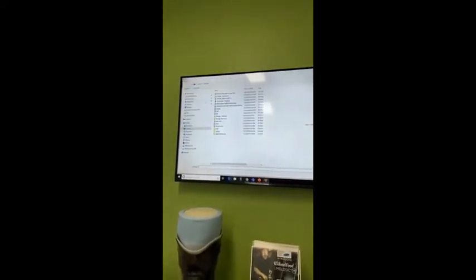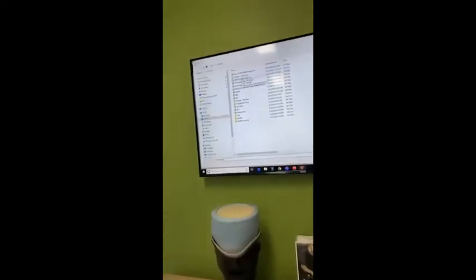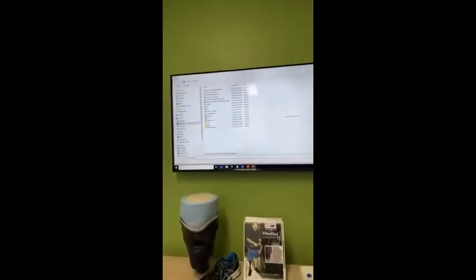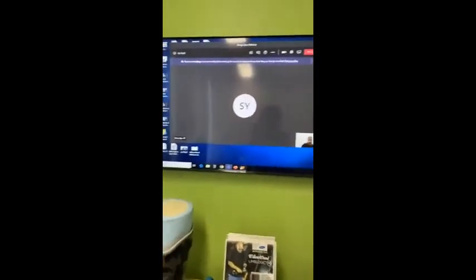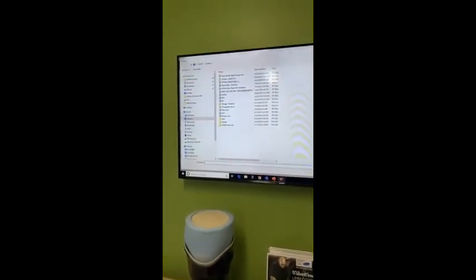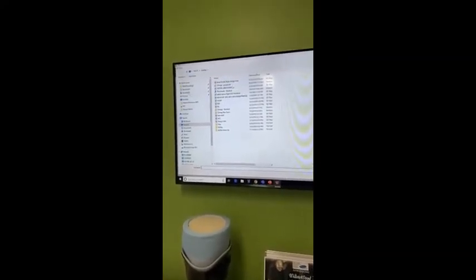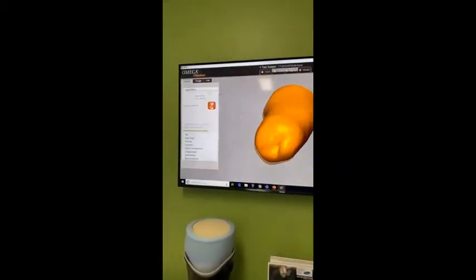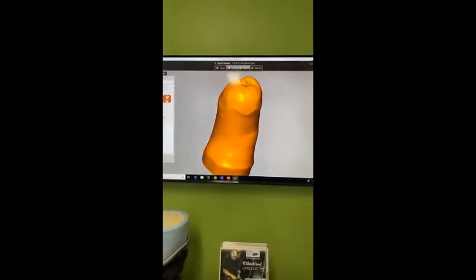So again, we import a file. And yeah, just go check what the file was called, design liner. Desktop, there it is. So here, yeah, we've got a distal end with some invaginations there.